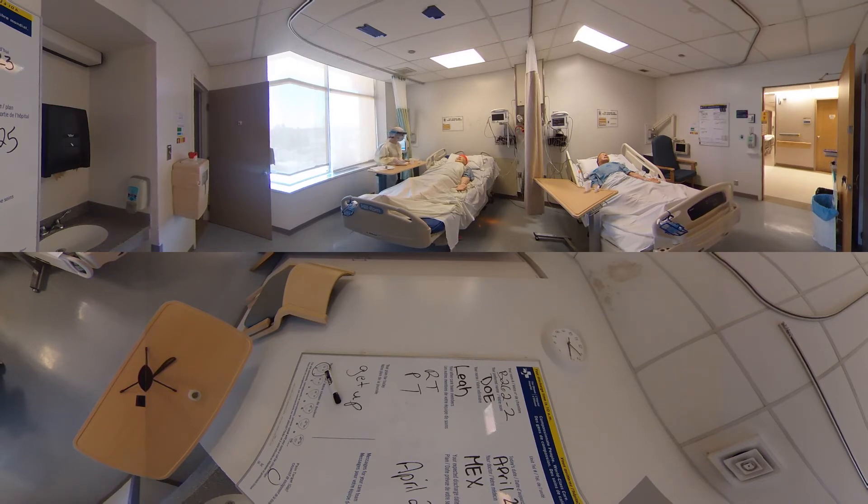I'm going to check your blood sugar if you don't mind, just before breakfast. I'll enter my employee number, scan the patient, and scan the strip lots. I just need to see your finger here. Do you have a preference? No, it doesn't matter. So your blood sugar is 8.5, so that's perfect.